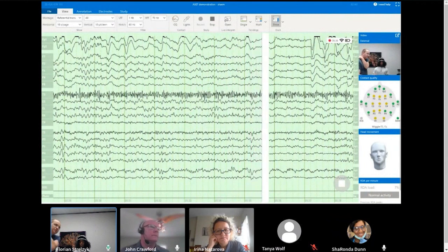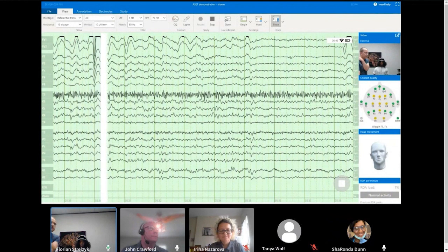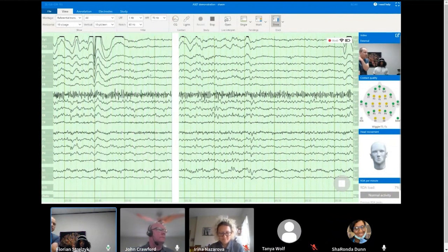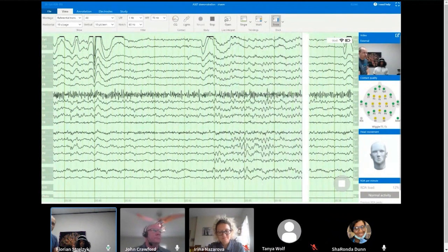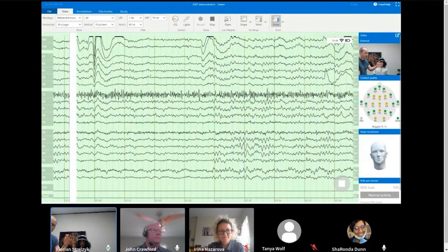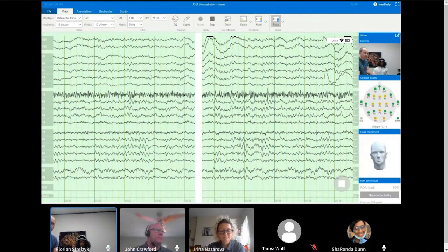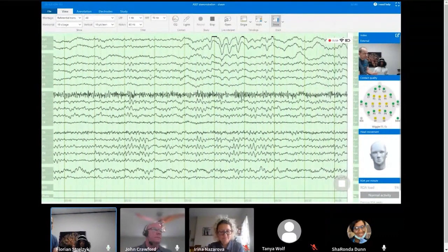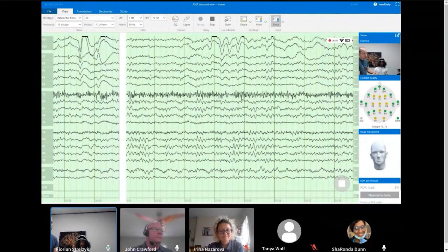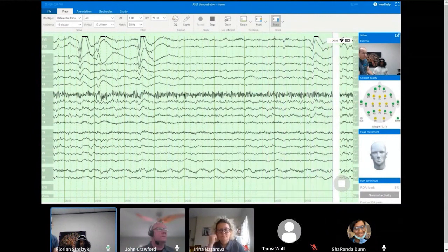Is your goal to say seizure, no seizure? Do you need this for triaging? Do you need this for regular routine EEG? What is your goal for this study? By just waiting here a little bit, all these yellows will turn green, but on their own. But if your goal is just, hey, we need to see the seizing, where the seizing, then this is pretty much as you have to do to answer that question.